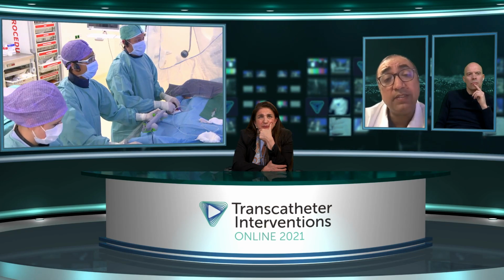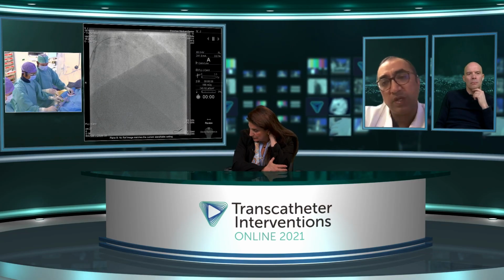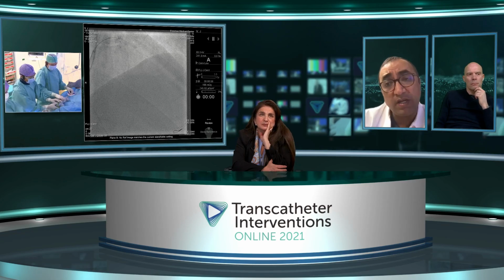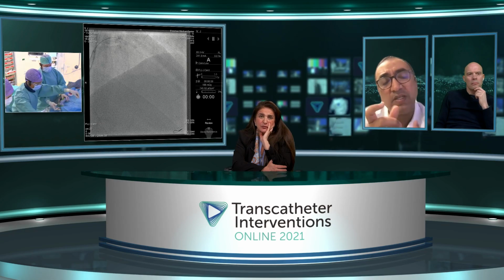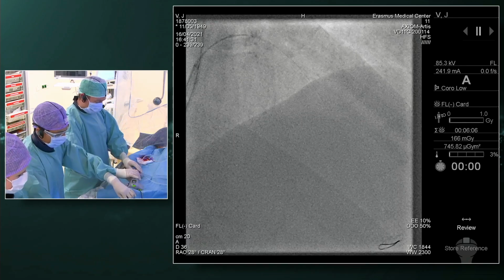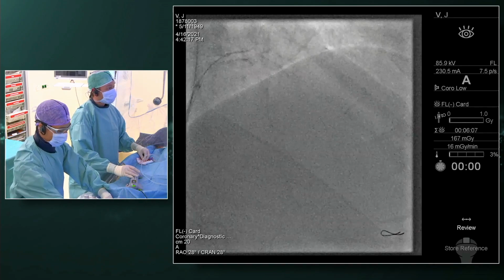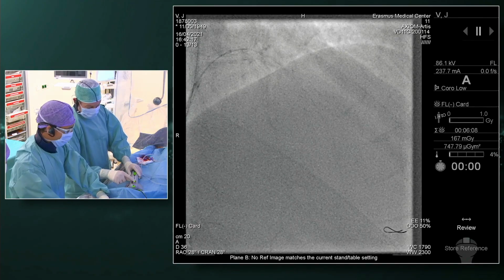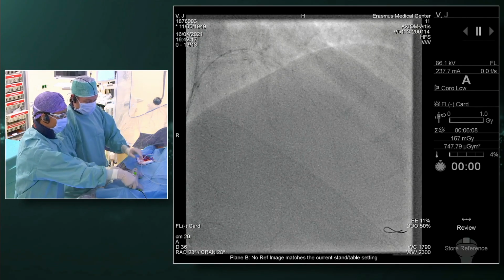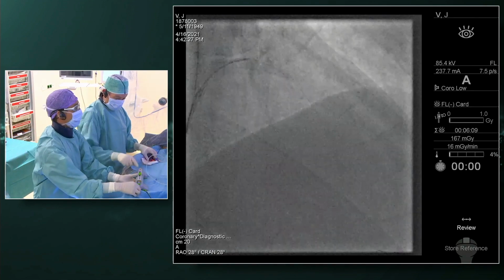It's very straight. I prefer to use CSI when I'm going into a straight vessel. Going around a curve or in a very tortuous vessel can be more challenging, so you need to be careful about that. What we tend to do in this case is go to the distal lesion, burr and sand the distal lesion, then move to the proximal lesion and sand that, and not do the area in between. We used to with Rota, starting the Rota and doing the entire area.